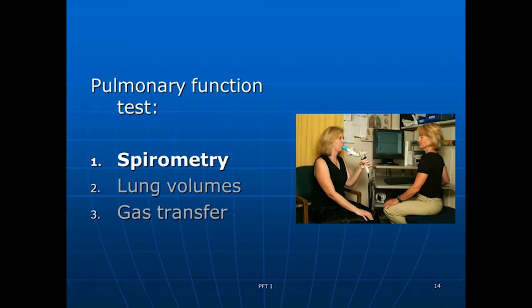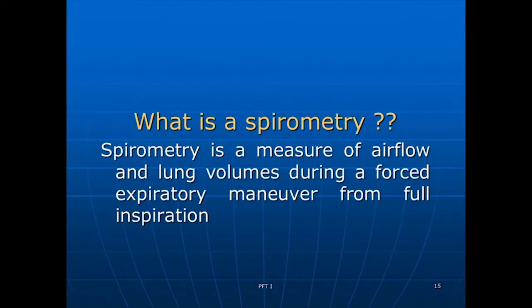So again, they take the biggest deep breath in that they can, and the therapist will tell them to blow it out as quickly and as forcefully as possible. And I'm going to show you a little video at the end of the lecture so you can actually see these pulmonary function tests in action.